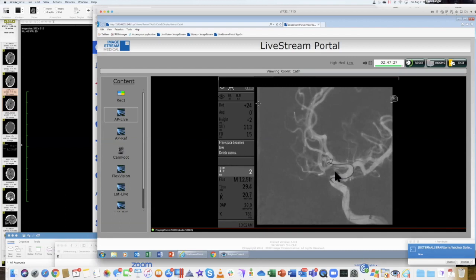You can see he's having a little trouble getting that second coil going into the dome. And it keeps coming out, almost too much resistance. You probably talked about this already, but just for the students to understand, this was a surgical disease, an open surgical disease. This was a brain surgery that people got for years and years. And now through a needle hole in your groin, 4 feet away, a surgeon is able to cure your aneurysm. It's kind of incredible.